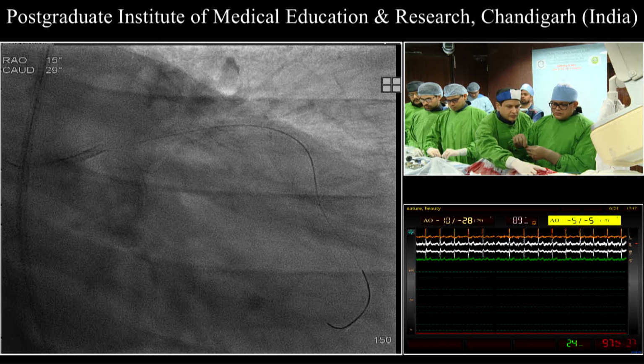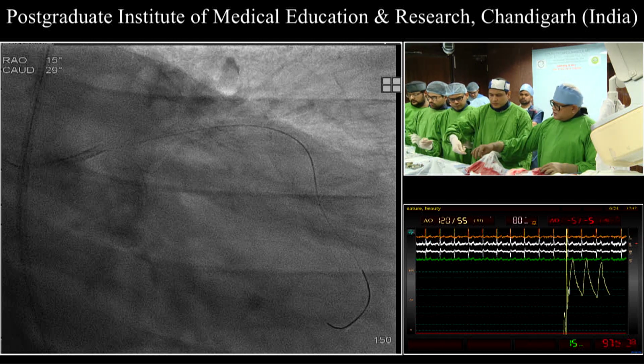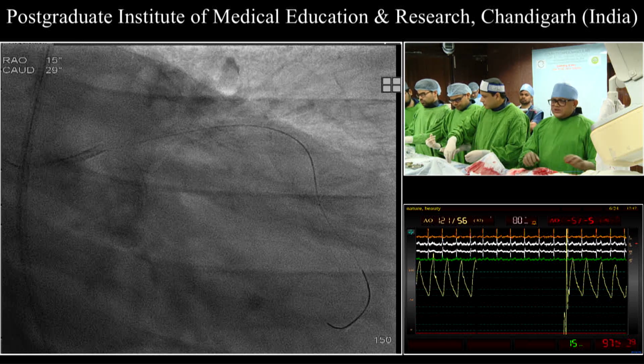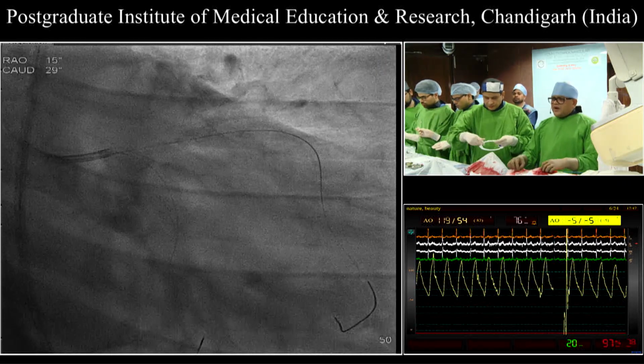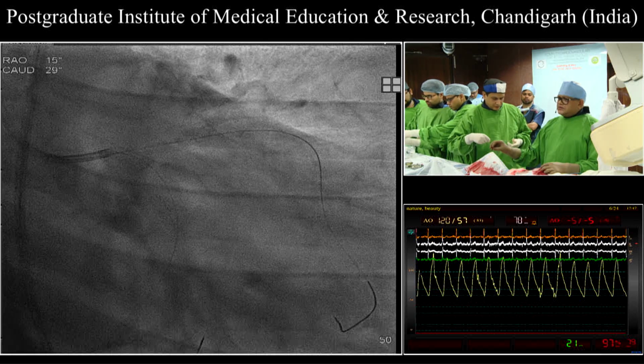So which size and length of cutting balloon did you select now? So I have selected a 2.5 millimeter cutting balloon, but I am not able to push it across. So let me try the 3 millimeter non-compliant balloon first, and then push the cutting balloon across.